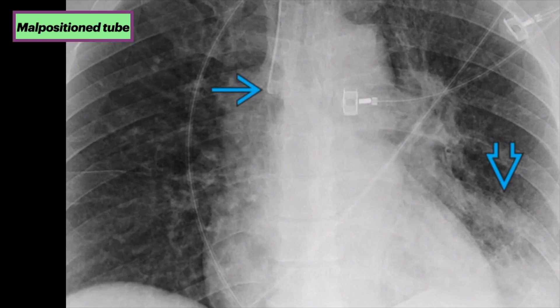The next case is a malpositioned tube. On this chest x-ray, note the malpositioned endotracheal tube with the tip in the right main stem bronchus distal to the carina, with resultant atelectatic changes in the left lung.